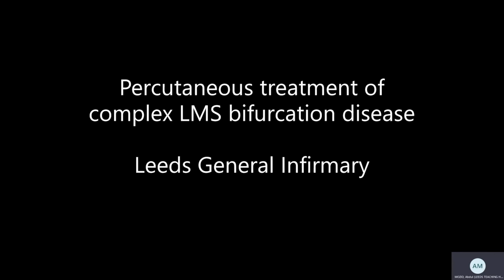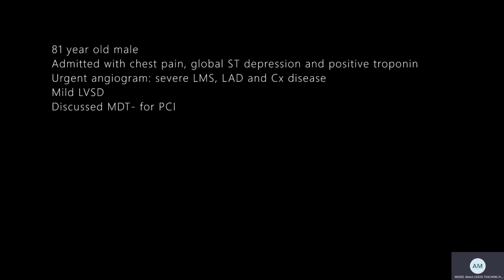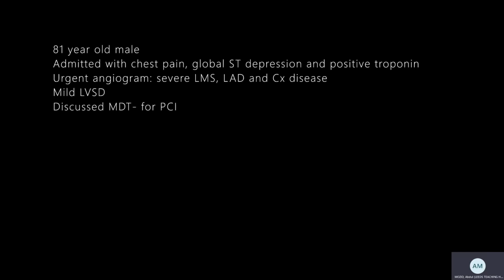This is a case of percutaneous treatment of complex left main stem bifurcation disease. I am Dr. Abdul, a consultant cardiologist at the Leeds General Infirmary. This case was performed with my colleague Dr. Murugu Veerasamy as first operator.